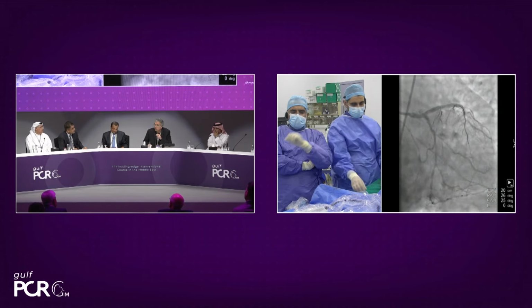Thank you, guys. What we saw is the additional value of intracoronary imaging using OCT. And it's true that for my generation, when we worked 25 years ago on this kind of lesion without OCT, we had only angiographic guidance. We did not have this kind of images in front of our eyes, and it was simpler for us to treat just by looking at the angiographic image. Today, we have these intracoronary images showing thrombus or a stent not well deployed.